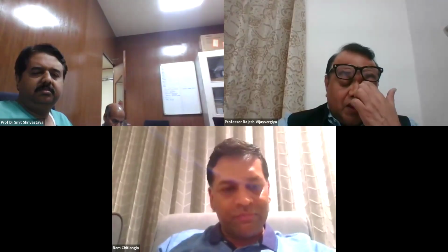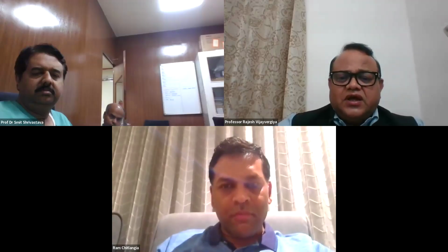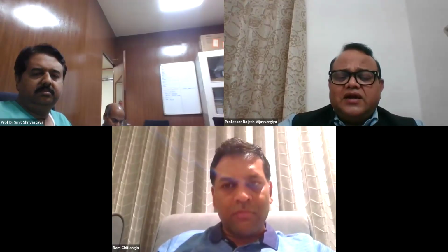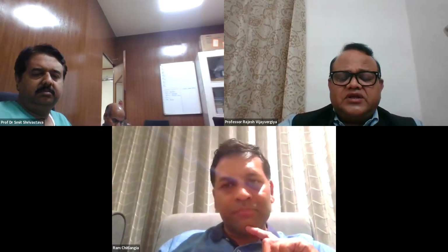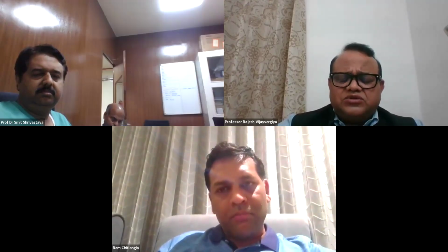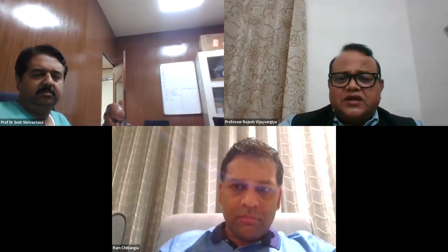So see, with the FFR, which is 0.9 across, I'll say it doesn't require any intervention. And here, to go ahead with intravascular imaging is not advisable unless you have dilated the side struts. Otherwise, there is a risk of imaging catheter entrapment when you have not had a balloon dilatation across the LCX. So that's one thing. In case you are able to demonstrate an FFR value of 0.9, then there is no need to go ahead for side branch dilatation. That's one thing.